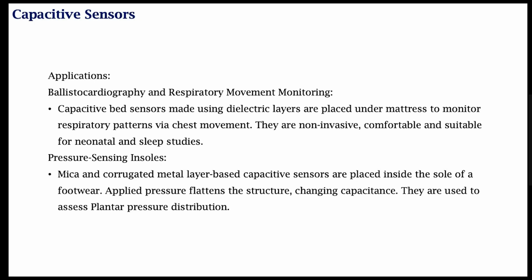Now, that is another phase. While you are sleeping, you can measure. While you are sitting, you can measure, and your foot you can measure. So all of these are specific applications of a simple technology. We'll continue the inductive sensor discussion in the next class.